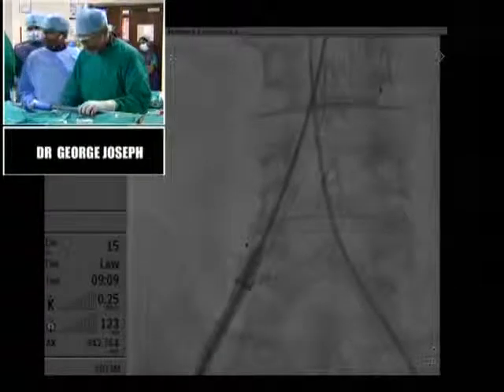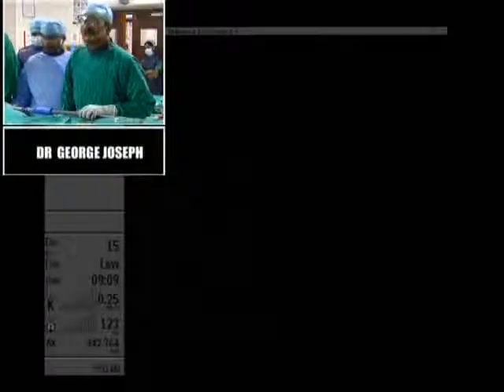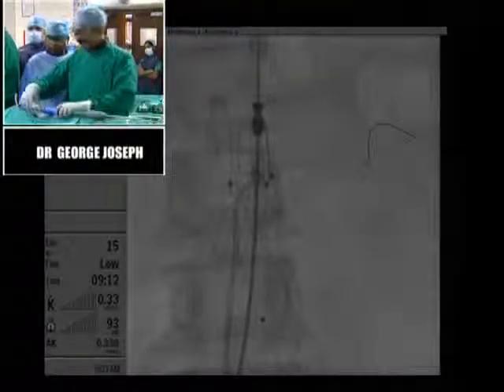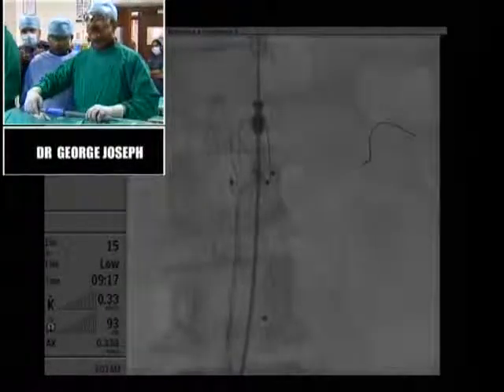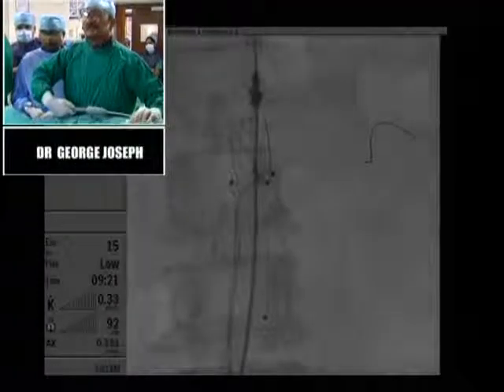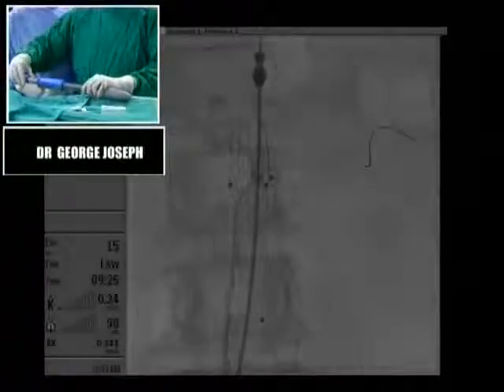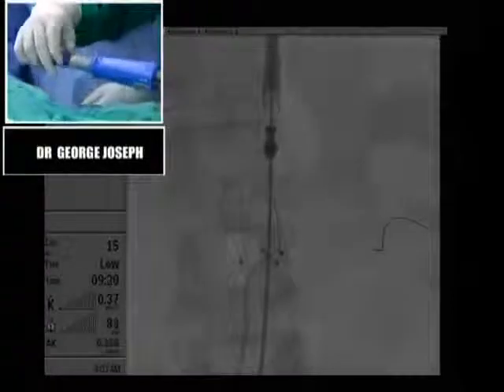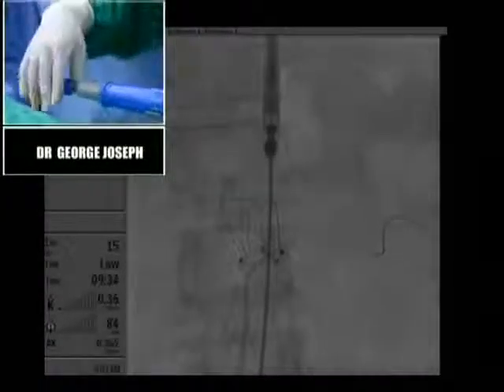Now let's have a look at the top, please. Yeah, okay. So now I'm going to reverse this. Move it up, about a centimeter or two away from the bar. And now I rotate this blue knob in the opposite direction. Show a little higher up, please. So that brings the nose cone back onto that radiopaque knob that you see.